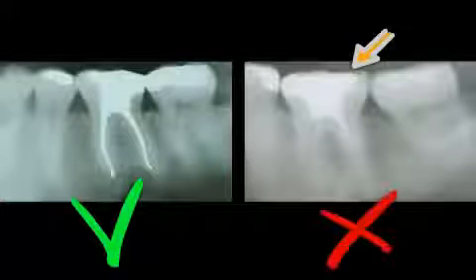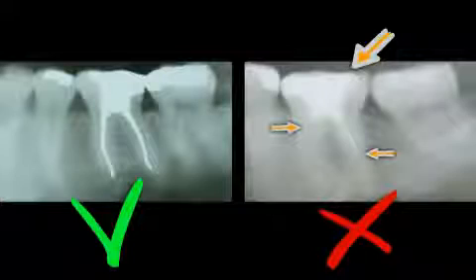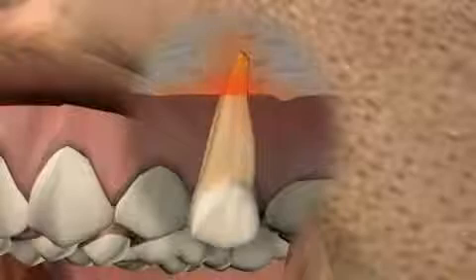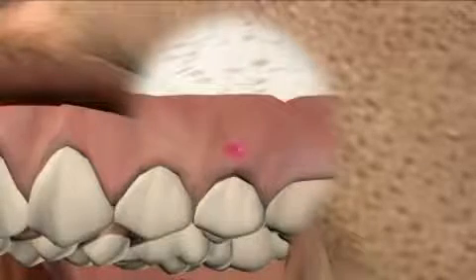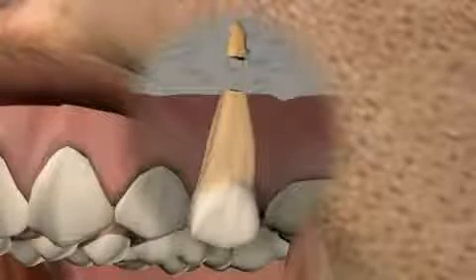On the right, you see an example of a tooth with a badly executed root canal. The root in the front was not filled at all, while the rear root was only filled halfway. Such teeth can cause trouble even after many years and can lead to a variety of complications, such as an acute bone infection or an abscess. In this case, a root end resection and/or a tooth extraction would be necessary.